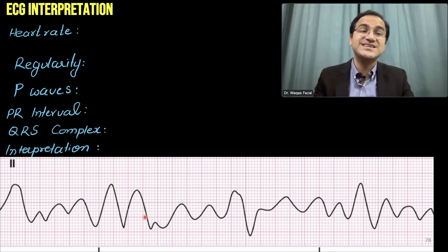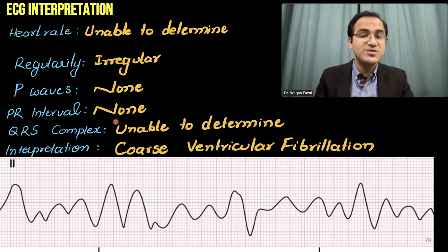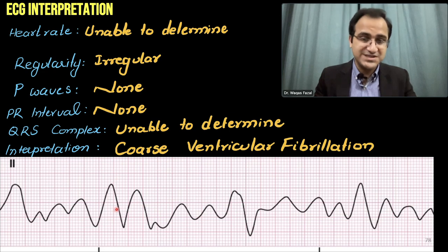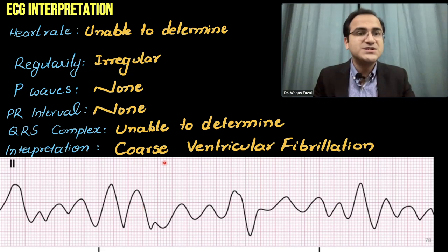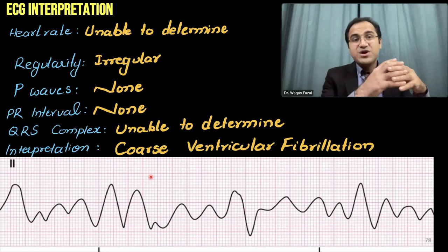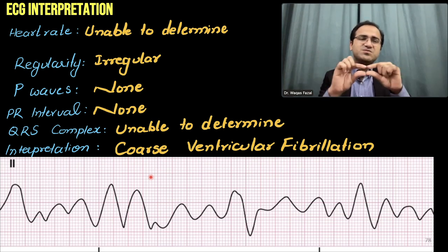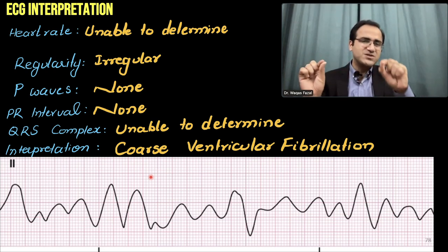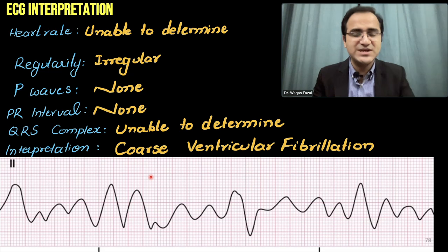Looking at this ECG of ventricular fibrillation: heart rate unable to determine, regularity irregular, P waves none, PR intervals none, QRS complex unable to determine — interpretation is coarse ventricular fibrillation. There are two types: coarse ventricular fibrillation, which has prominent waves, and fine ventricular fibrillation, which is more like a straight line but has small squiggles and bumps. That is called fine ventricular fibrillation.